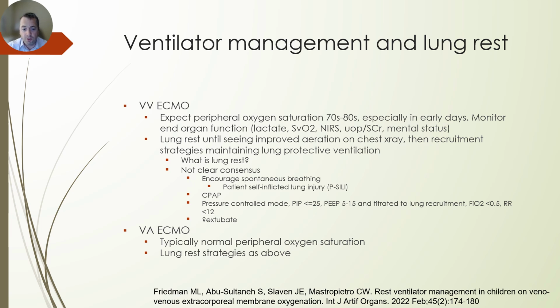Other folks do CPAP or a pressure-controlled mode with relatively low settings, titrated to lung recruitment. And there are also some who get extubated and are on VV ECMO with no breathing tube at all. All of those are valid and may be dependent on the patient and the institutional practices where you are. VA ECMO patients typically have a normal peripheral pulse ox, and you may still be doing some lung rest strategies as appropriate.